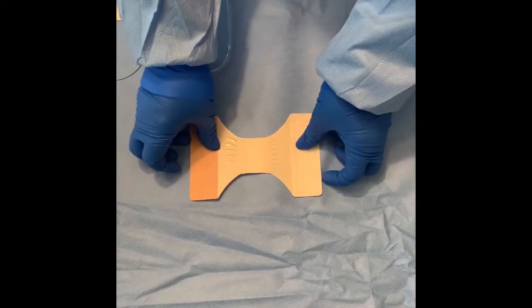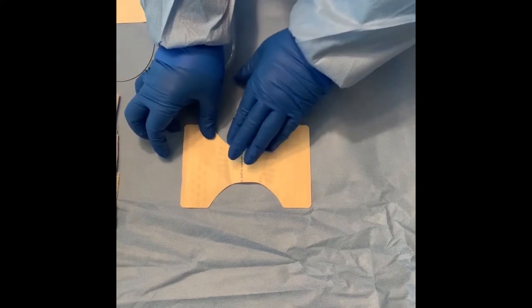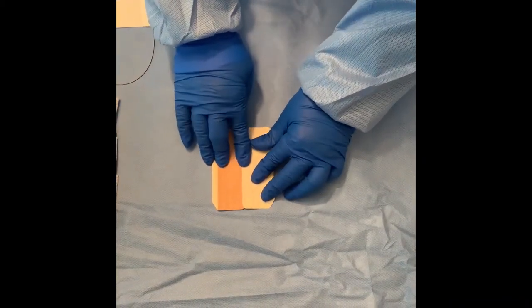Lay the bandage on the table with the protective sheet up. Fold the tan side to the center of the Telfa Pad and crease it. Then fold the white side to the center of the Telfa Pad and crease it.